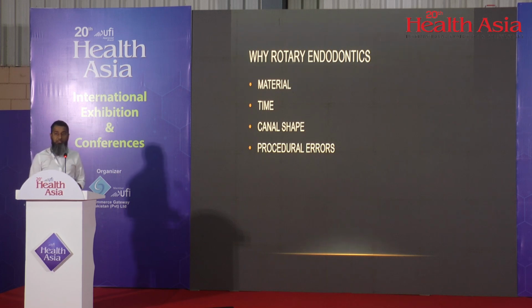The other main reason, which I think for a good clinician, is that time is the most important thing. Whenever a patient asks us the cost of treatment, we tell them that the cost is based on our time. It's not based upon the cost of the material that we are using. It is the time that we are giving you, that is the value of the root canal treatment. So with rotary, you can do a case in a single visit. With manual, you may be able to do it, but to do a proper case of a molar, you may take quite a long time.